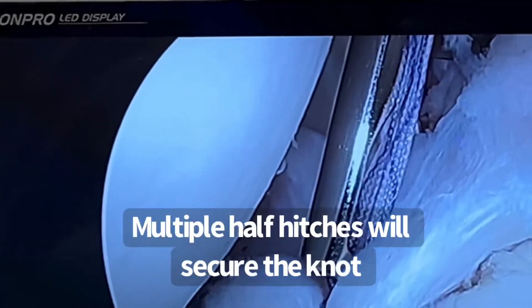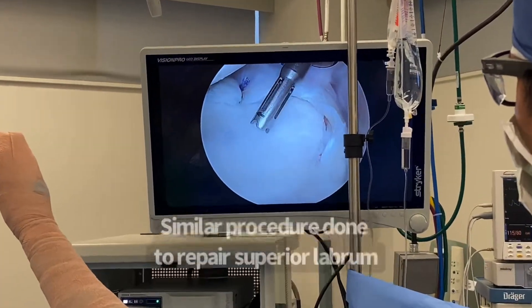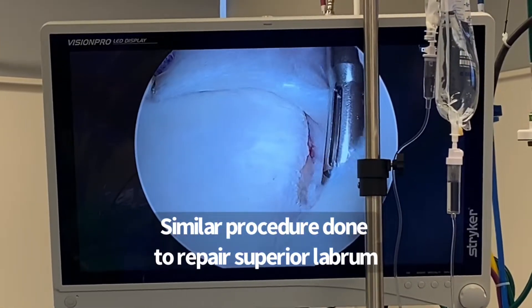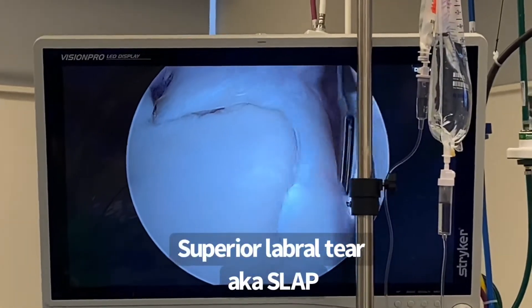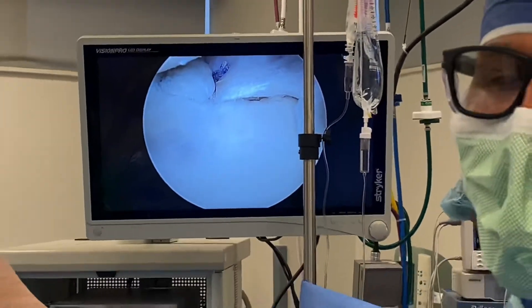Labral repair on an athlete that had locking and catching in their shoulder. So here now it's a drill guide, and what I'll be doing next is repairing the superior labrum — that's this structure right here — which kind of looks like an o-ring. I like to describe the labrum as an o-ring.